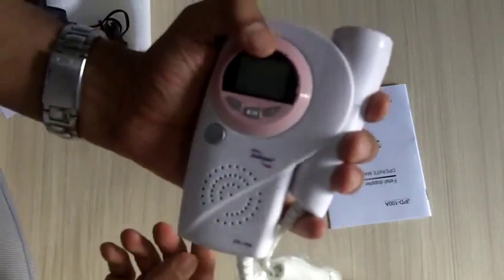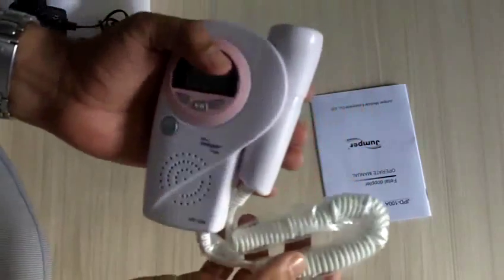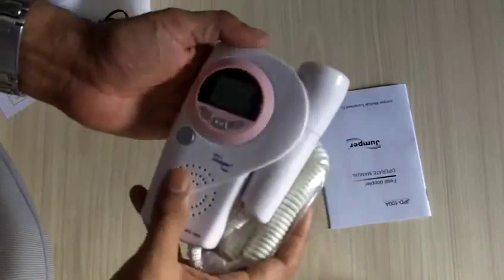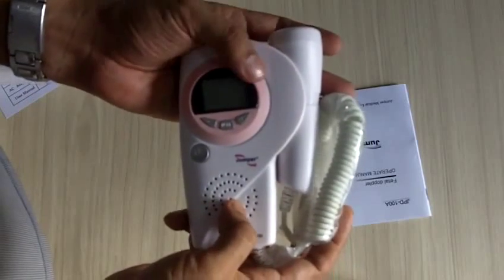It's really simple to use — very easy, very light, with a smooth curve. It can easily fit into any kind of laptop bag or purse. It's quite versatile and great value for the price.